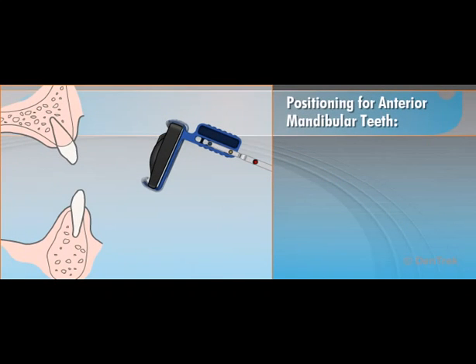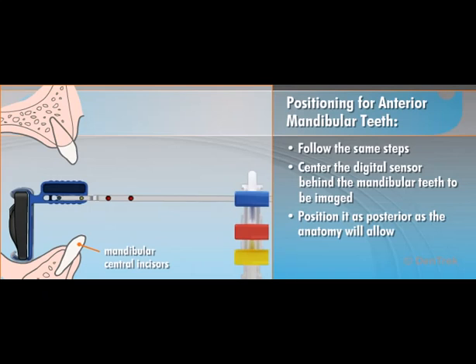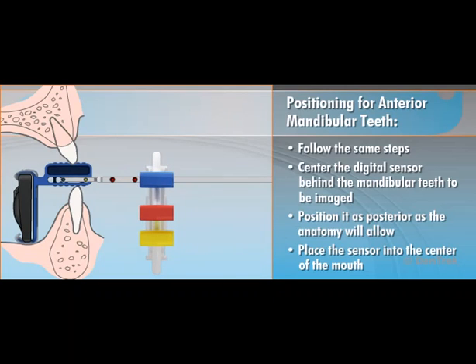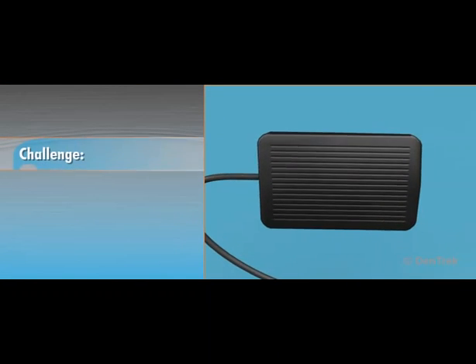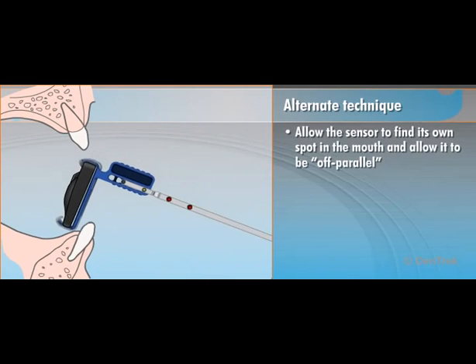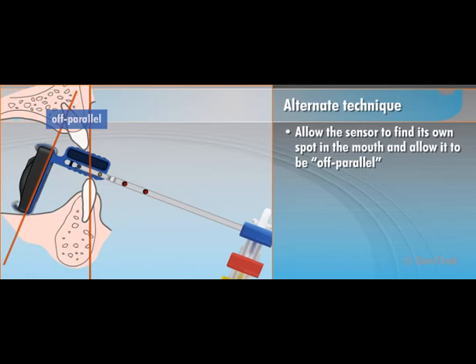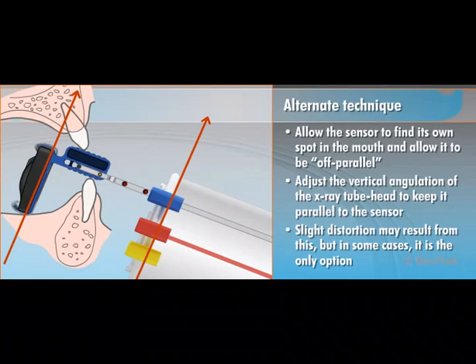For anterior mandibular teeth, follow these same steps, centering the digital sensor behind the mandibular teeth to be imaged, positioning it as posterior as the anatomy will allow. Placing the sensor in the center of the mouth where there is more room to accommodate it will allow better alignment and more patient comfort. With a sensor, it is sometimes difficult to place the sensor parallel to the teeth due to its size and inflexible nature. For patient anatomy that doesn't allow parallel placement of the sensor to the teeth, allow the sensor to find its own spot in the mouth and allow it to be off-parallel. To minimize elongation or foreshortening, adjust the vertical angulation of the X-ray tube head to keep it parallel to the sensor. Slight distortion may result from this, but in some cases it is the only option.